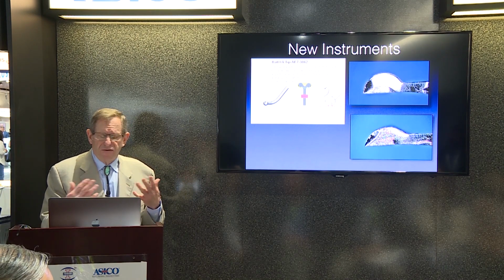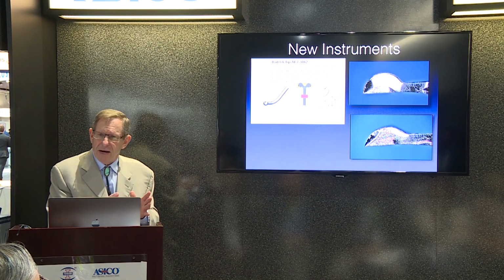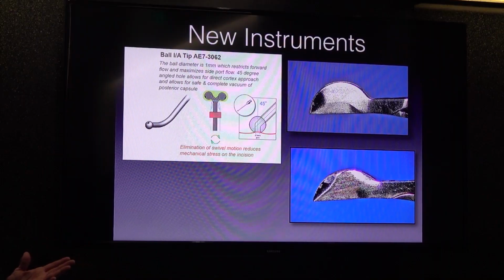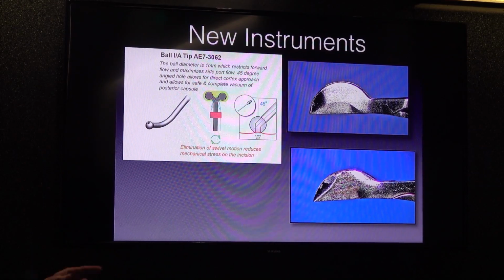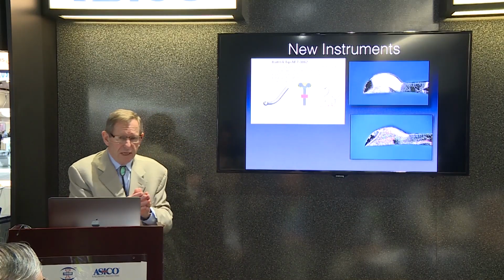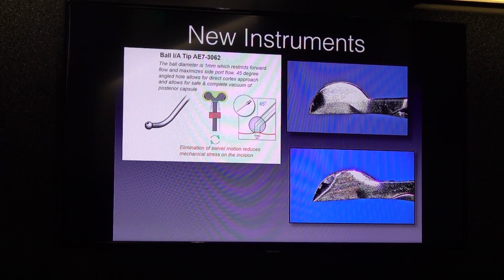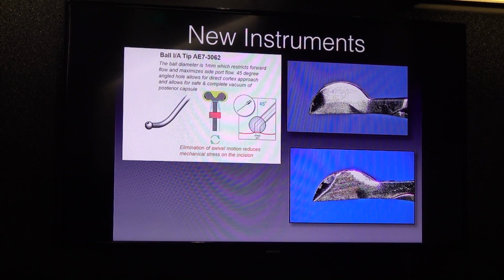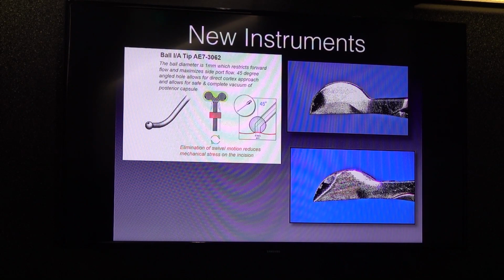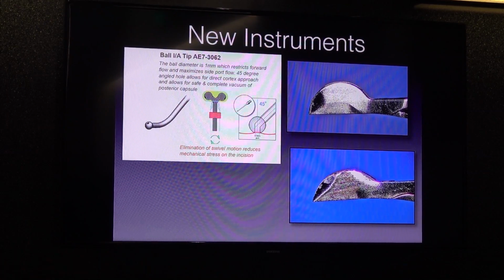So I have 3 or 4 different pre-choppers for the density of the cataract. A soft cataract is almost not worth pre-chopping. You can try, but it just splays it apart. What I'll often do, depending on how hard it is, is just start it and then reverse the paddle so the rounded part is towards the capsule, and then you can go in and get it spread apart. But it's not very efficient, and super hard ones are not very efficient either. There you need Abe Vasavada's technique of multiple chops, or variation of vertical chopping versus horizontal chopping for those, which is really not part of this discussion.